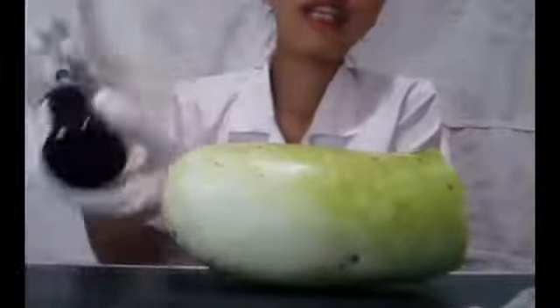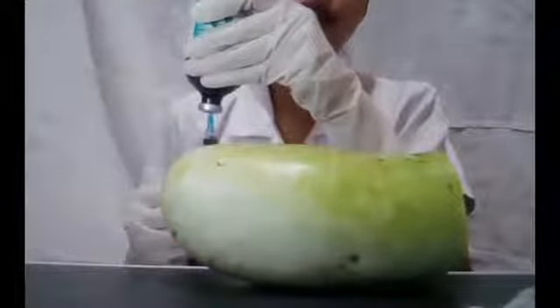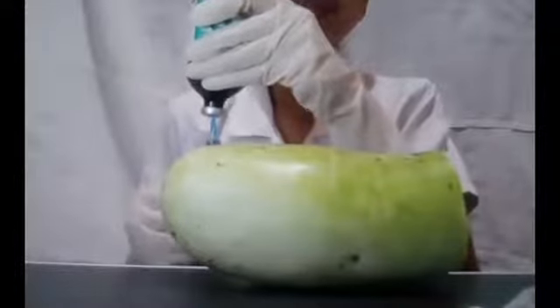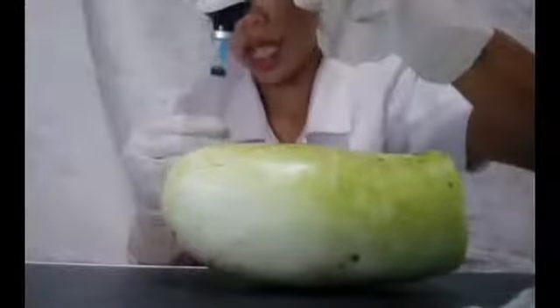And now we will turn it upside down, and the same amount of 0.5 ml of air, you need to pull back 0.5 of the medication.